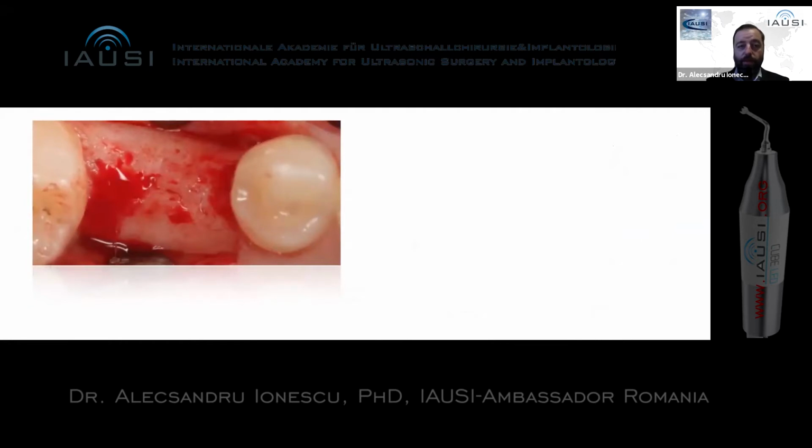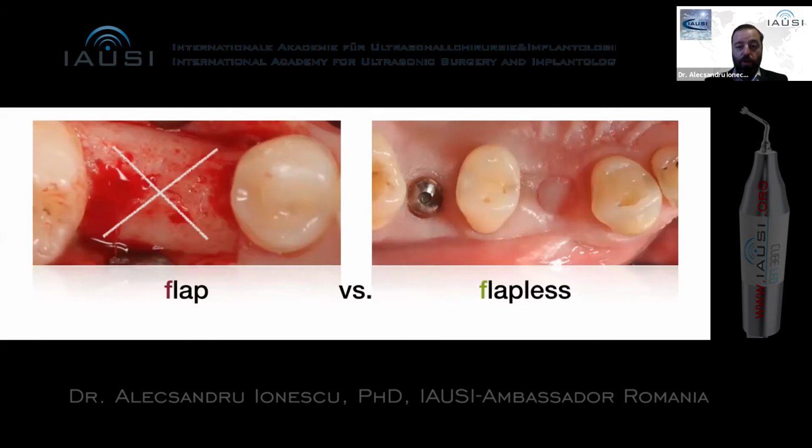Everybody remembers how we used to do even one single implant more than, I don't know, 12, 14 years ago. So we raised a flap, either a bigger flap sometimes or a small flap. We decided like 14 years ago that we need to think about avoiding this strategy. So we started using and implementing in our office the flapless approach.